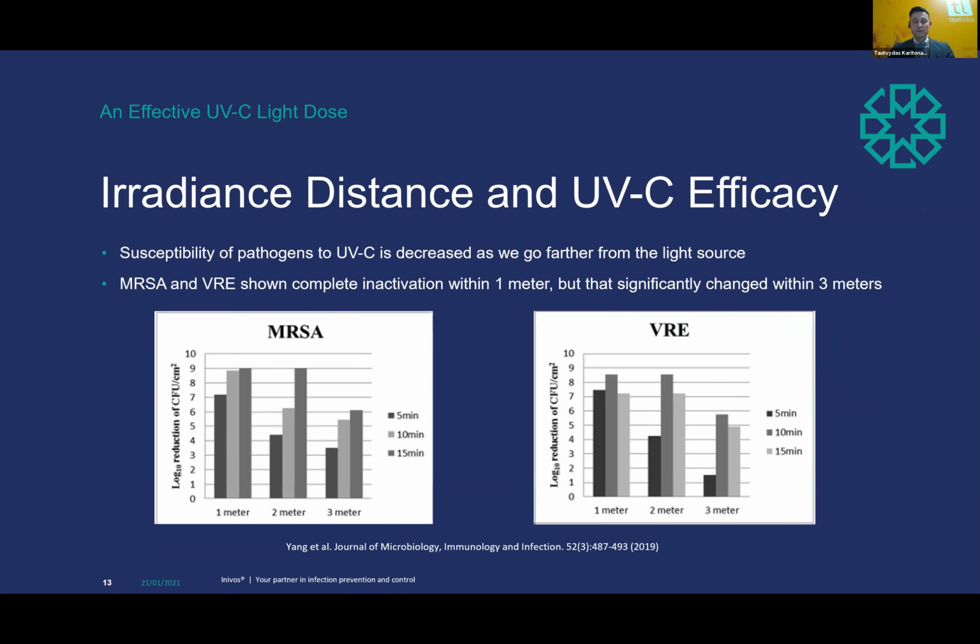So there's a lot of evidence to suggest that different doses have different responses in killing microorganisms. I think we need to find out whether we need to achieve that dose in a specific amount of time to make sure we kill everything and don't leave bacteria behind, potentially causing resistance to develop.